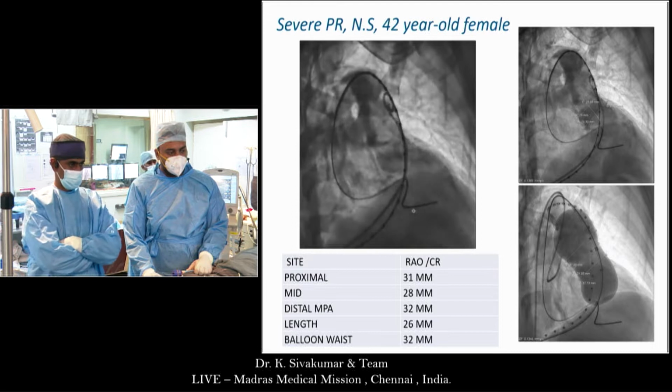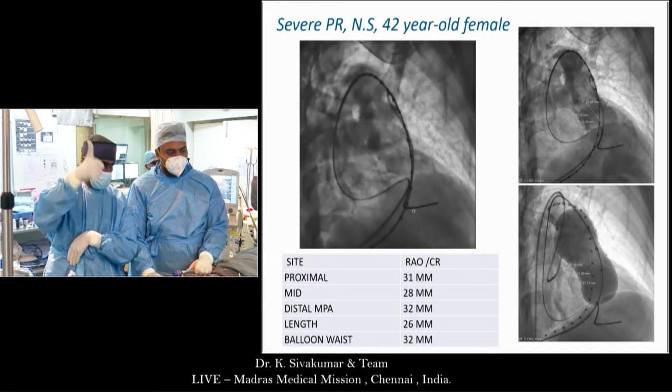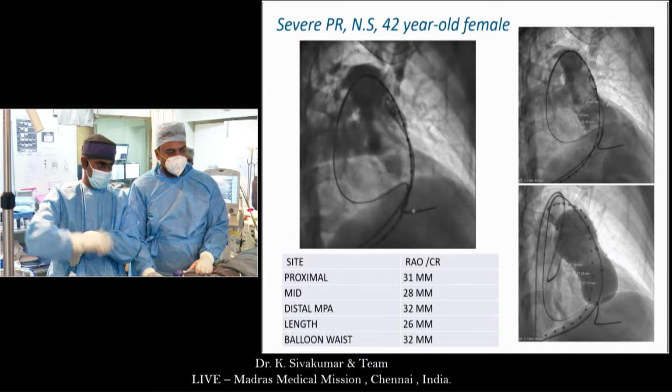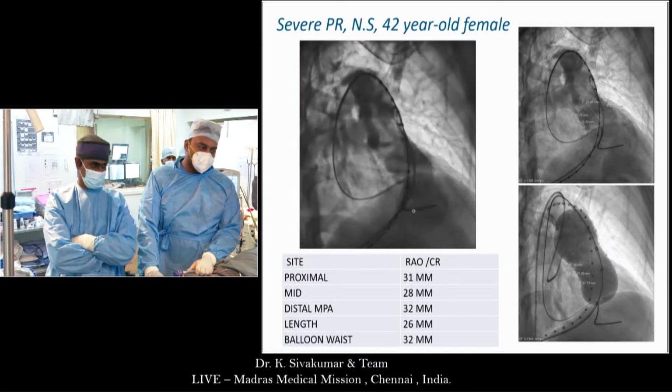So what type of balloon is that? I think it's a sizing balloon, right, Shiva? Okay. Thank you. All right, so I'll try to read your mind.